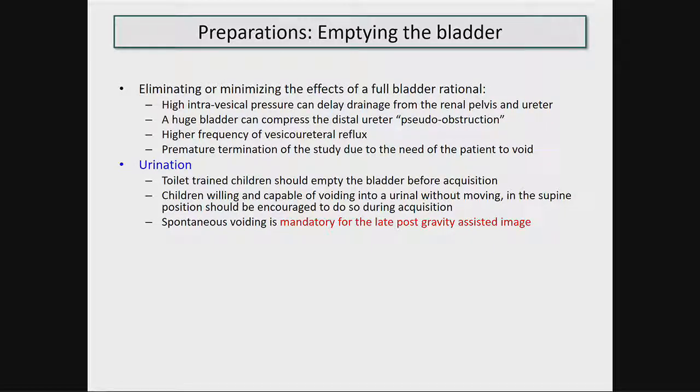And spontaneous voiding is mandatory for the late post-gravity assisted image. So if you can't achieve earlier voiding, then definitely for the final image, if you get there, you need this to be a post-void image.